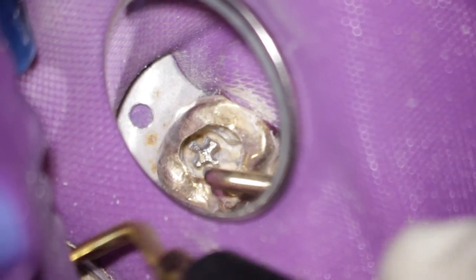Now another tip comes into action, which is actually uncoated. It has a broad tip and serves to deliver power to the post in order to destroy the cement gap in the deeper areas. This will lead to a high amount of heat, so water cooling is highly recommended.